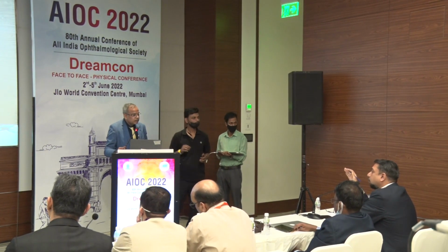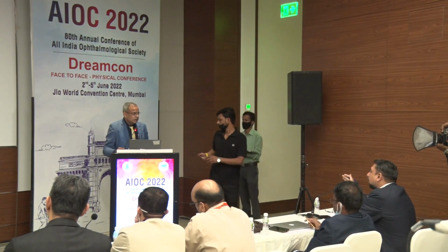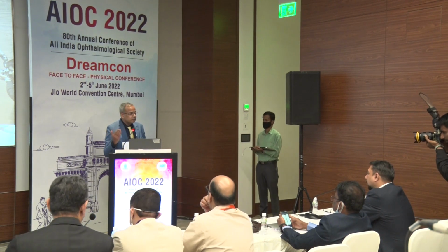Second point: how is the inter-observer variation if you use 2 qualities of cell phones here, a very high-end cell phone and a very ordinary cell phone? Have you noticed any difference in inter-observer variation? No, because we have this contrast and brightness, so we can grade any image. Only 5% of the images can't be graded. Otherwise, we have the contrast and brightness slider, so we can grade any image.